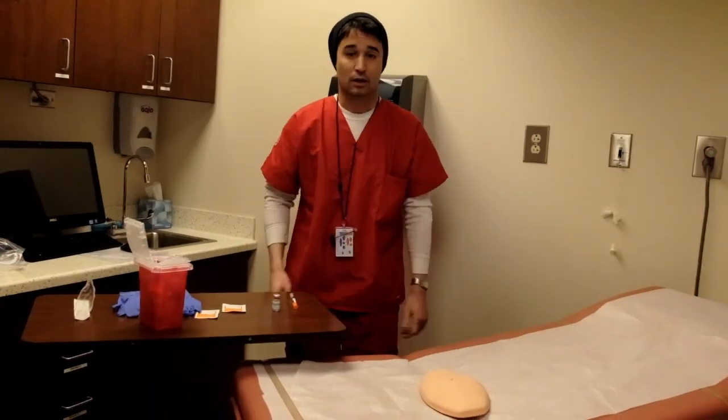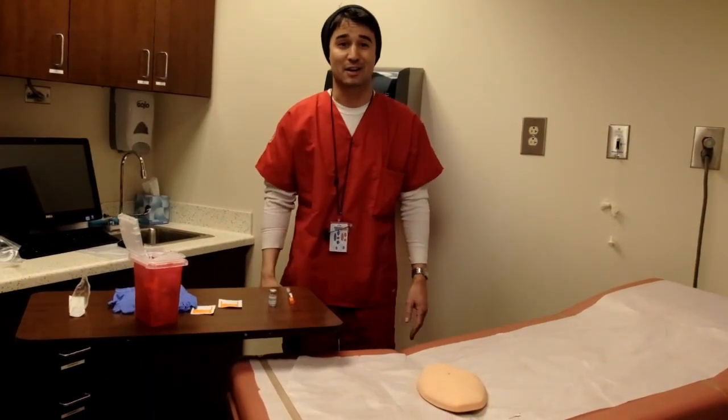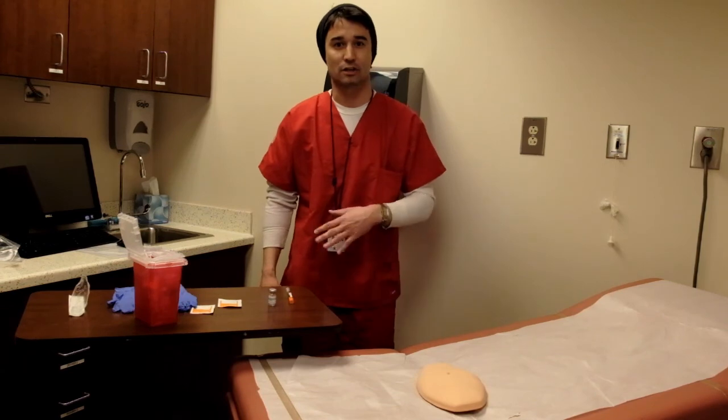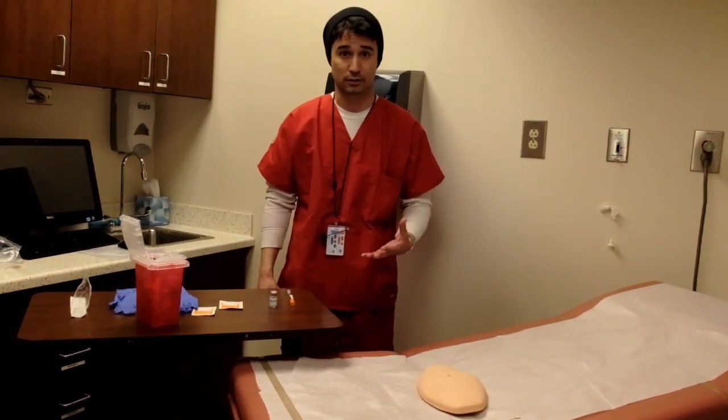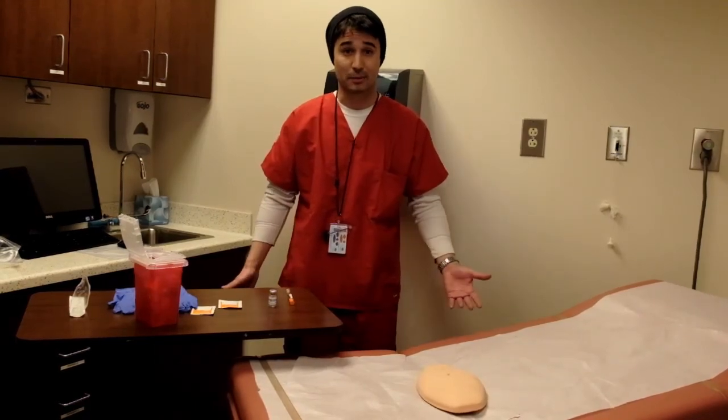Hi, my name is Justin Day, and I'll be demonstrating how to withdraw medication from a vial and how to administer a sub-Q injection as well. So let's go ahead and begin.